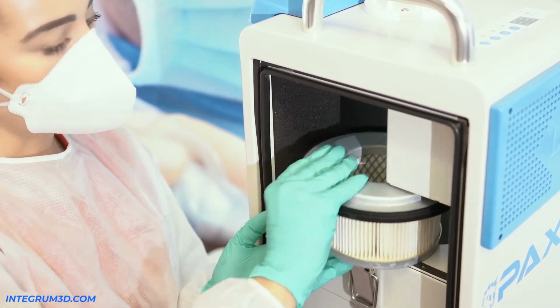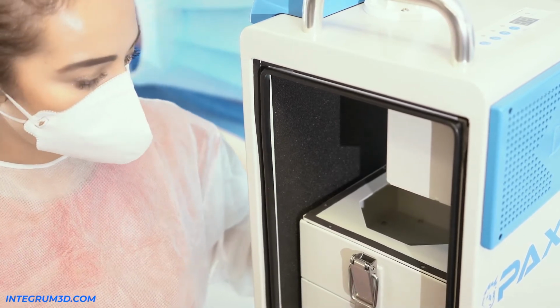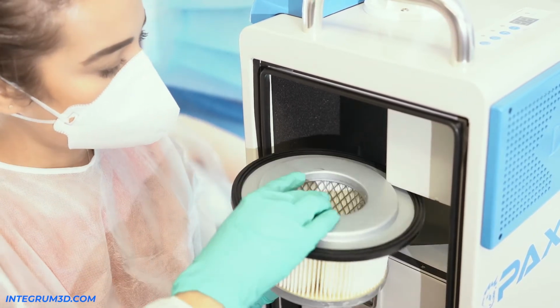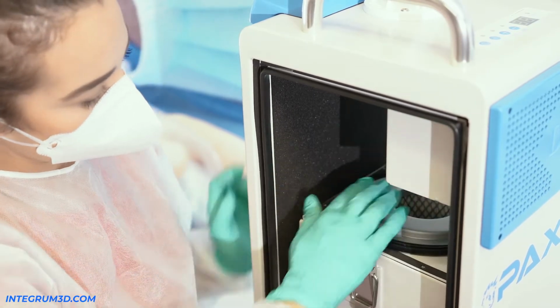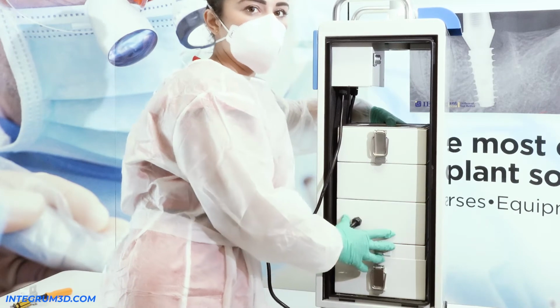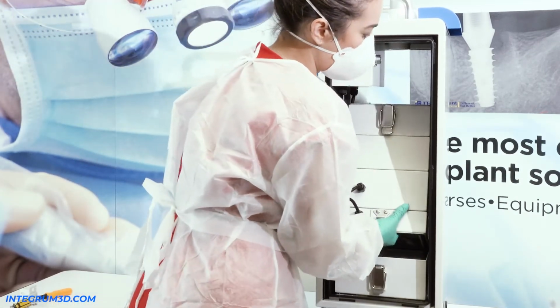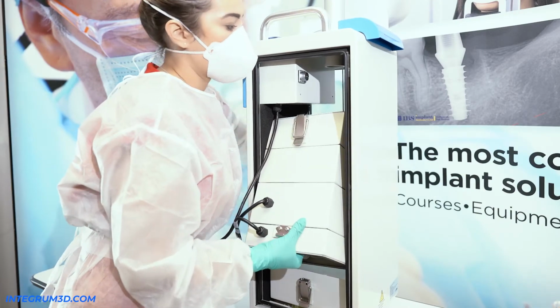You're just going to take it out and replace it with a new one. We want to make sure we take this completely out. All three of these compartments are connected. So you want to tilt it back away from you and then pull it out towards you.